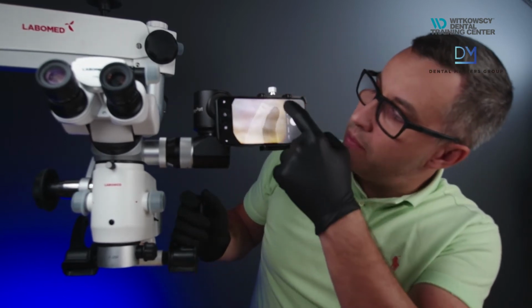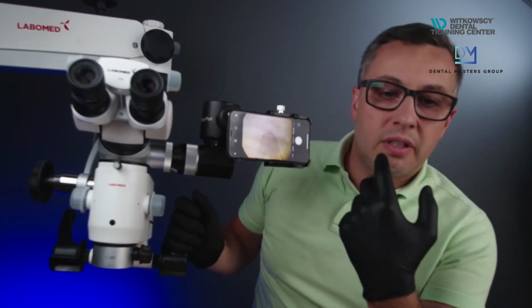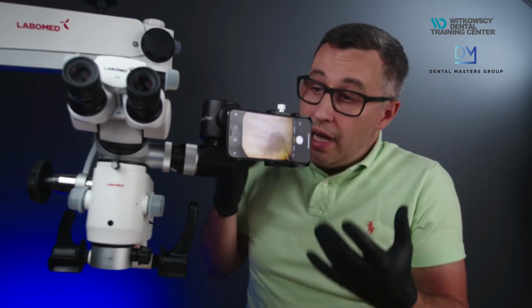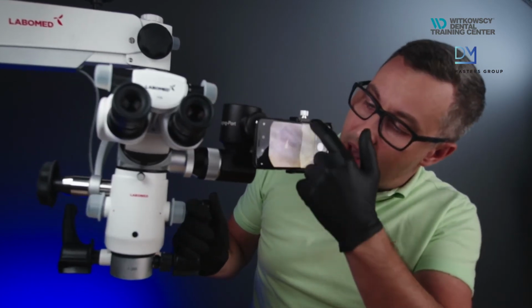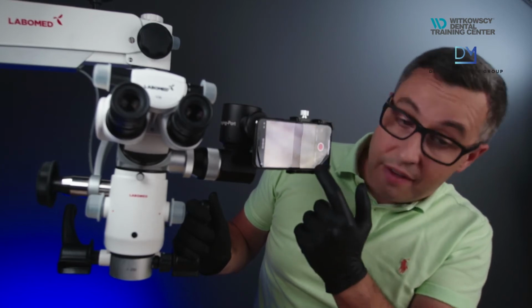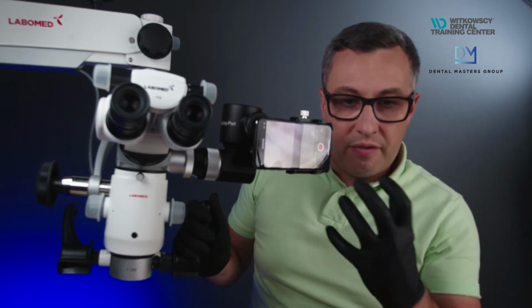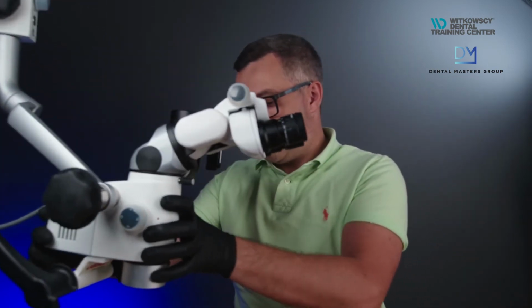In some phones, you might see a little bit of yellow here. Why? Because there are different phones, different focal lengths, different adapters, and this might be a problem. So different models can have this, and it's normal. The better thing, especially for iPhone, is to turn on the video, because on video it's much wider. It's 16:9, and the view is really good. And you don't have these problems as I showed you before in the photo.